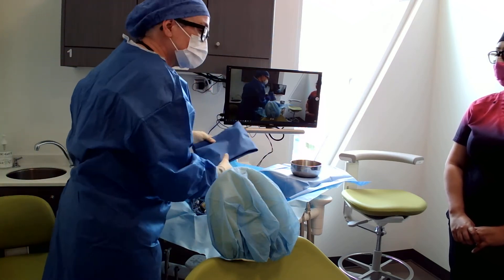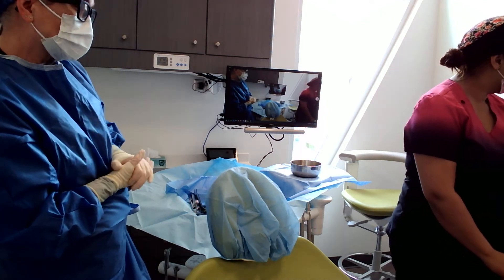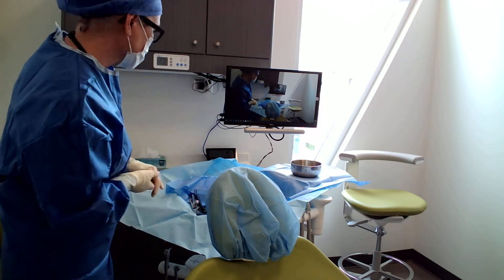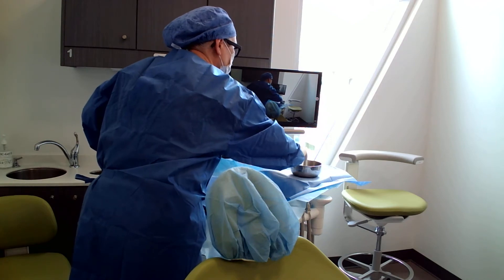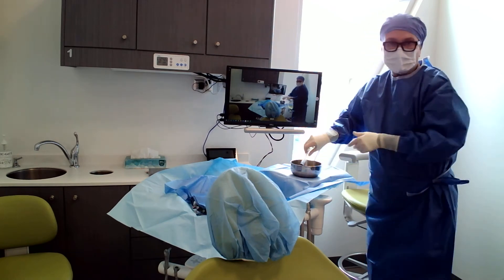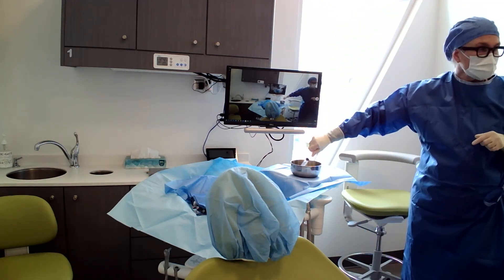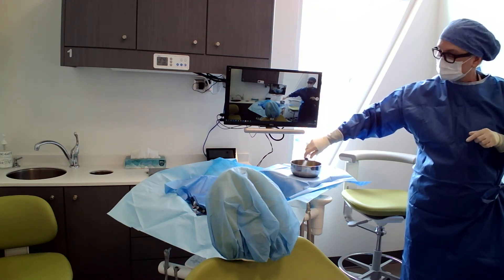I don't have any sutures — I forgot to grab some. So while we're waiting for Nina to grab sutures and a blade, I'll fill up my irrigation syringes. You get really good at doing this with one hand because you're suctioning and retracting and you don't have time to stop the surgery to fill them up. We throw these away after each patient — we don't re-sterilize them, they go in the garbage. Unfortunately, there's a lot of waste with surgery.